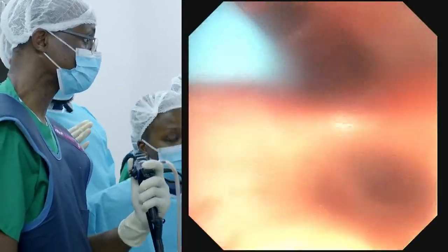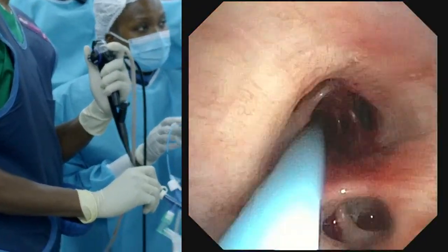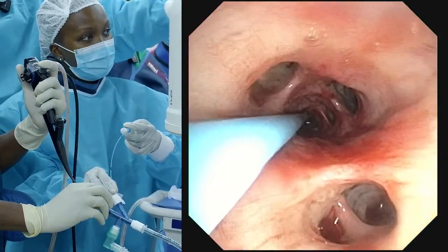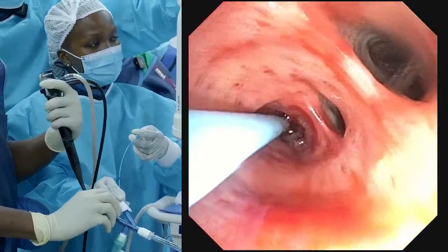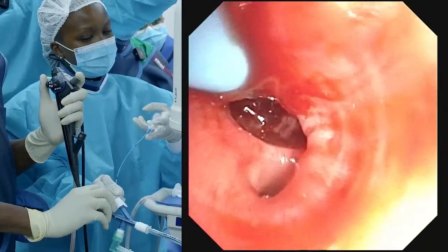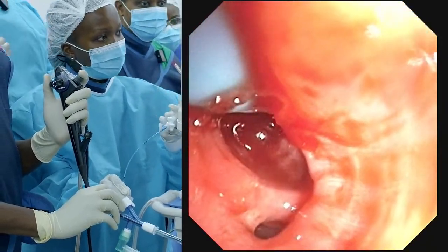Okay, so pick your segment. So you're going to pick where the balloon is. This is basal segments. Lateral and posterior. Take from either the lateral or posterior segments.